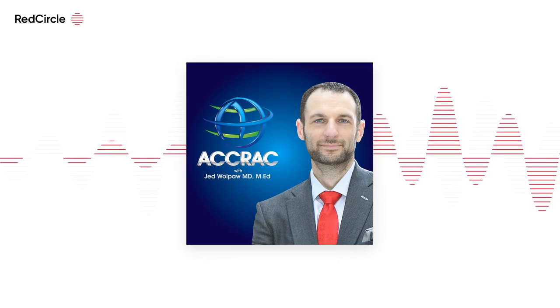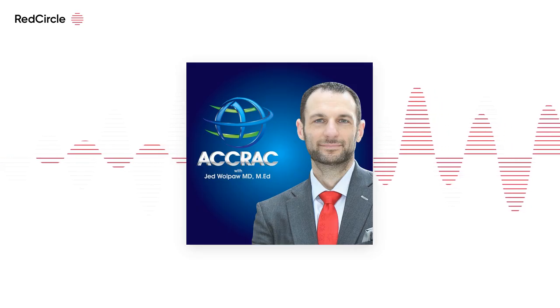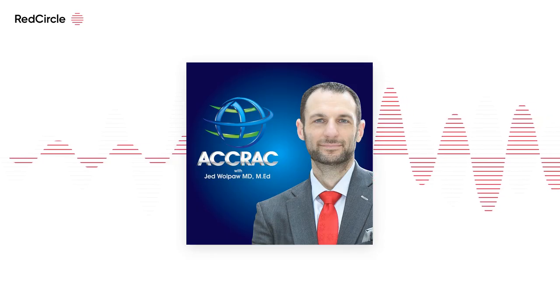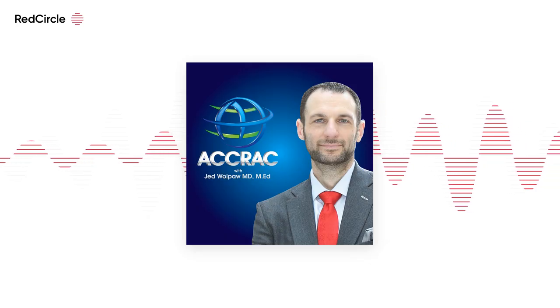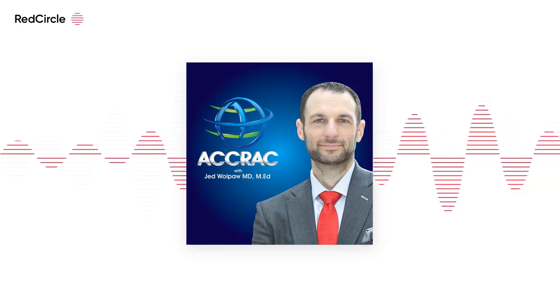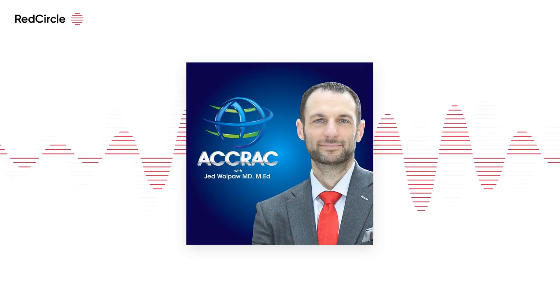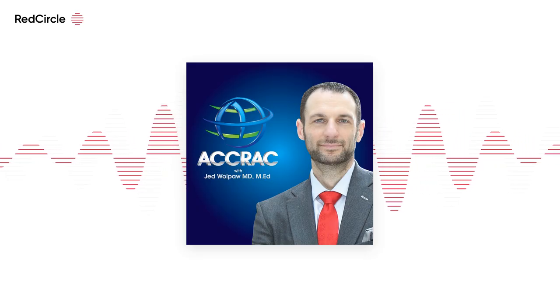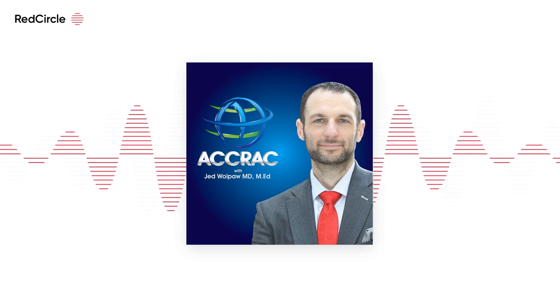Yeah, I think it's actually really crucial for all these things we're going to talk about. We like to imagine the lung in this idealized way where it's one balloon or maybe a couple of them and we draw it on a whiteboard, but it's not, right? It's a population of a zillion little alveoli, and they all may be very different. And probably the more different they are, the harder it is to manage them because we can't ventilate them all separately. We can only apply one pressure at the head of the airway. So I kind of see it more like population medicine.